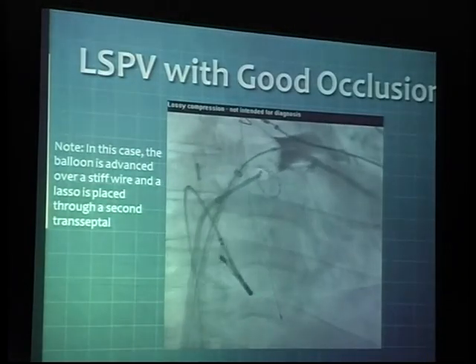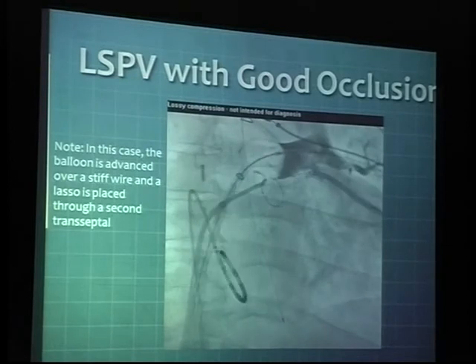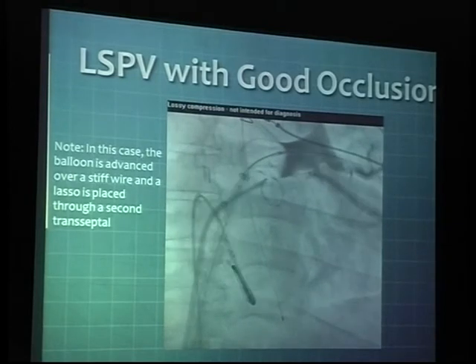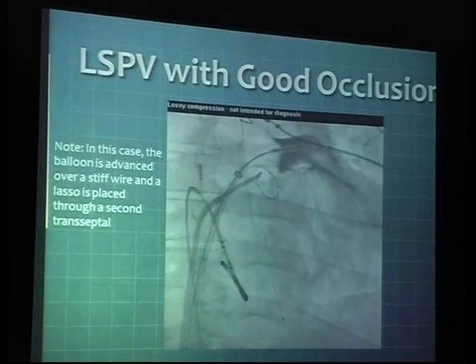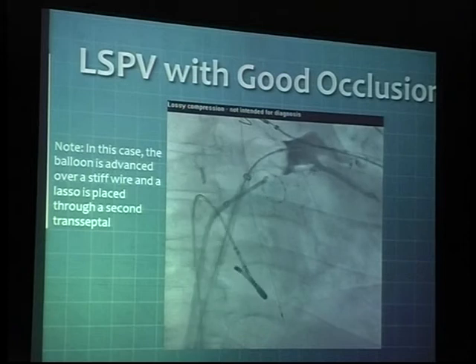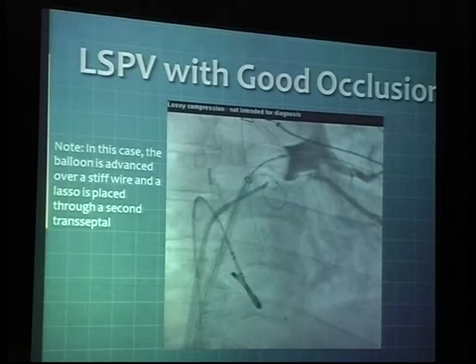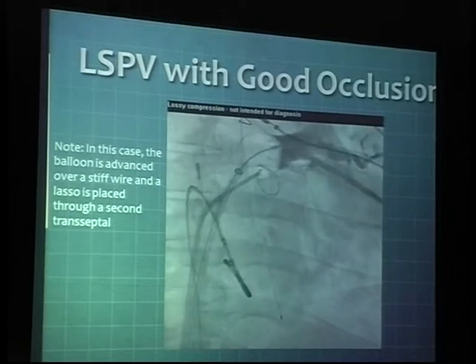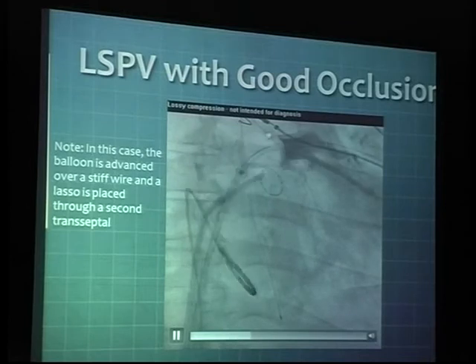This is the case where you're trying to get the LSPV from the tip of the cryoballoon catheter. You can actually inject contrast into it and then be able to visualize if you're able to accomplish good occlusion of the vein or not. This is a pretty decent occlusion here — once in a while you see a little bit of a leak from the superior aspects of that left superior pulmonary vein.